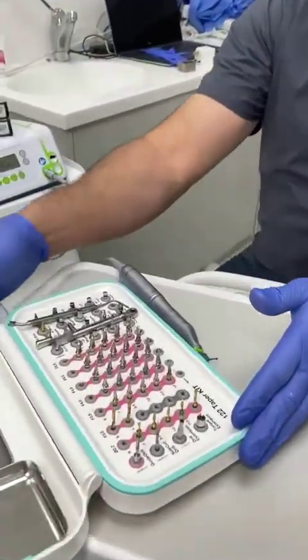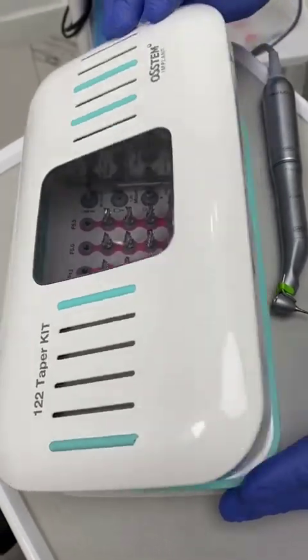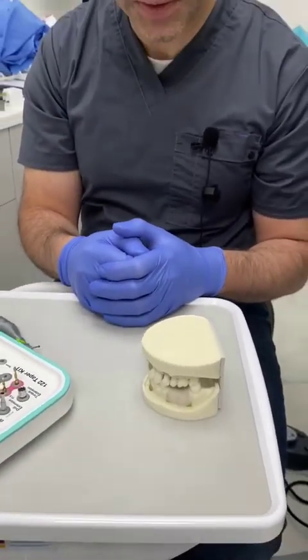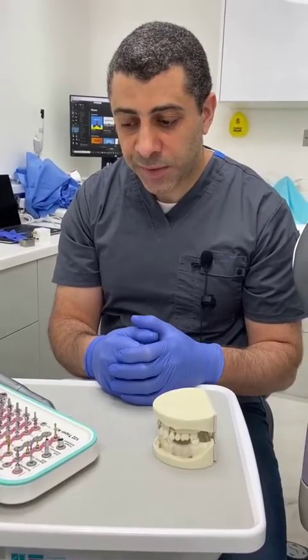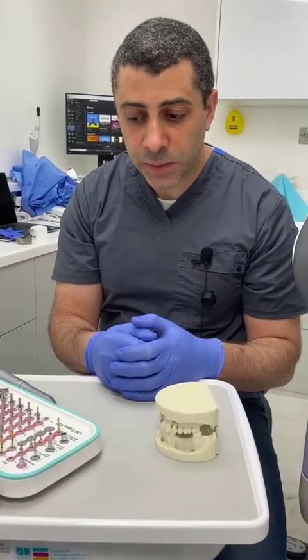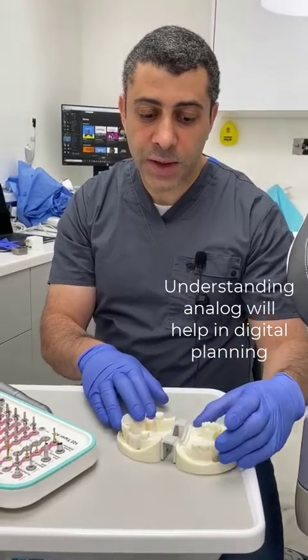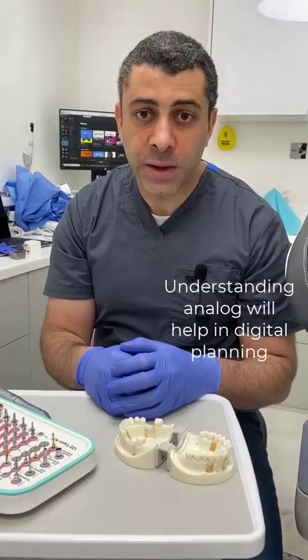We're using the OSTEM system, the OSTEM 1-2 taper kit, but the principles we're going to be describing here are the same for any implant system. The idea is merely to give you an idea of how things are done step by step and why they're done in certain ways. What we're describing here is the analog method of doing things, rather than the digital method, which will be covered in a forthcoming video.